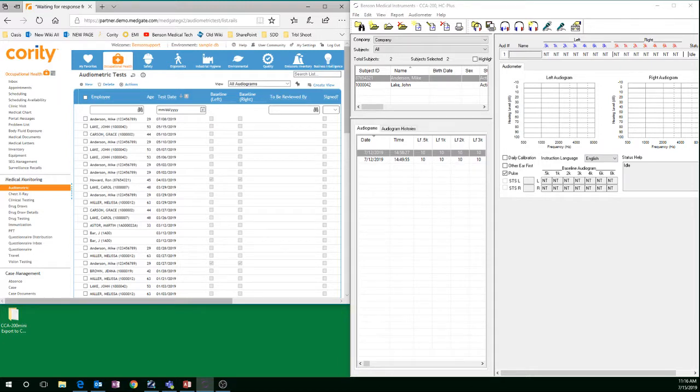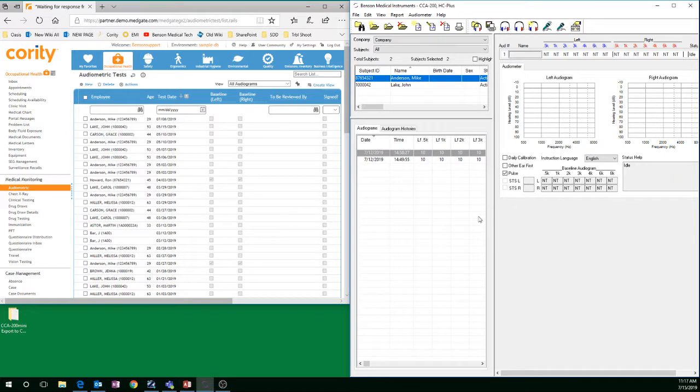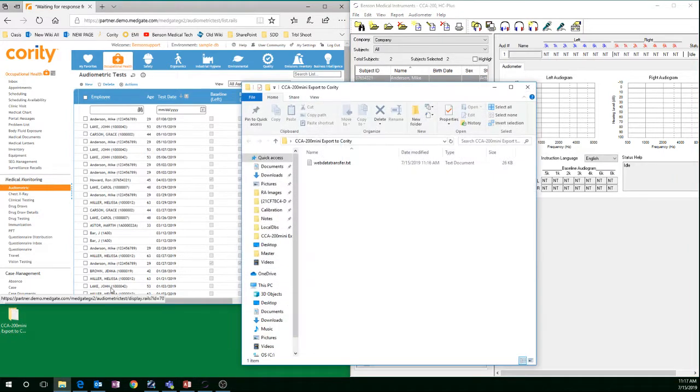The Exported Completed Successfully message will appear on screen. You can see the export in the folder that you've created.